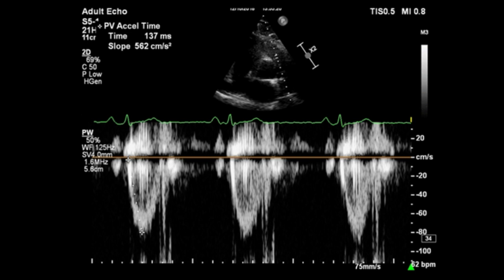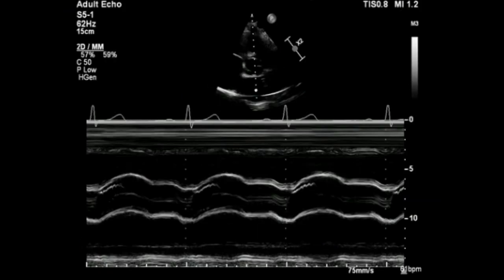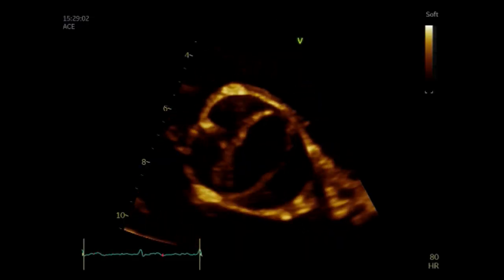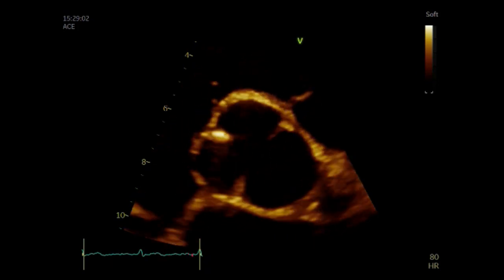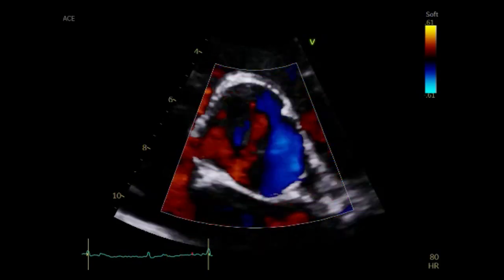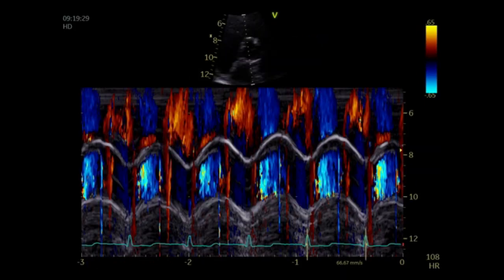Now that we've finished the assessment of the pulmonary valve, let's move to the assessment of the aortic valve. M-mode across the aortic valve can be taken at this level to visually assess and measure the RVOT, the aortic root, the aortic valve aperture and closure, and the left atrium. Now obtain a zoomed view of the aortic valve and visually assess the cusp morphology, thickness, and excursion. Use color Doppler to assess for any regurgitation and to identify the origin of the regurgitation. You can also use color M-mode across the aortic valve to assess the regurgitation.